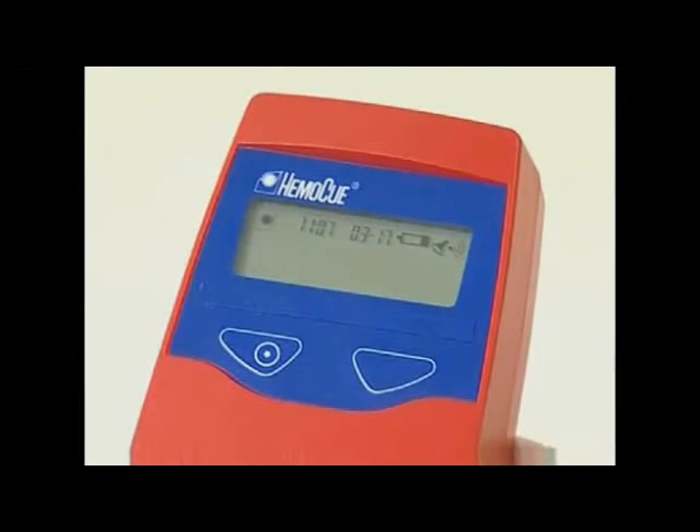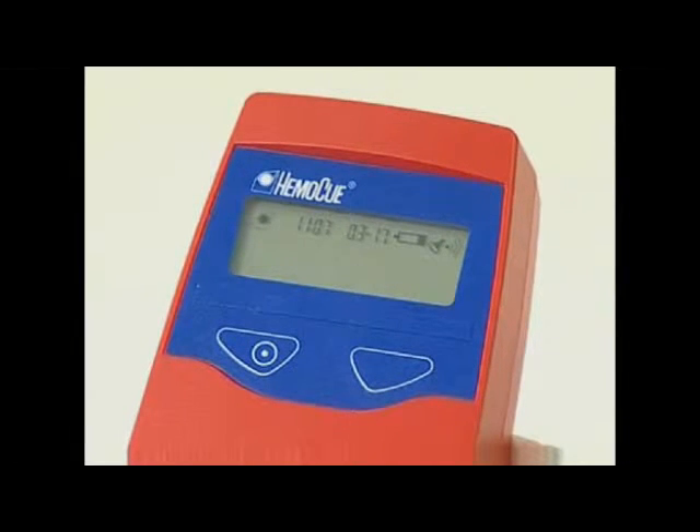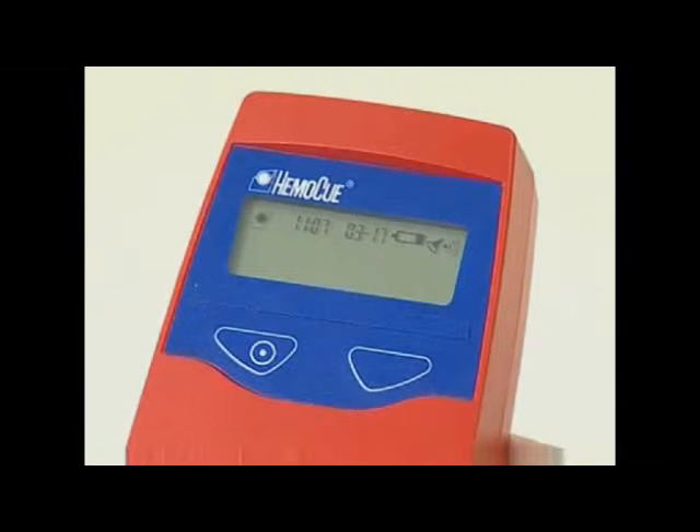If a battery symbol appears on the display, the batteries are running low. The analyzer will continue to give precise and accurate results, but the batteries should be replaced as soon as possible.